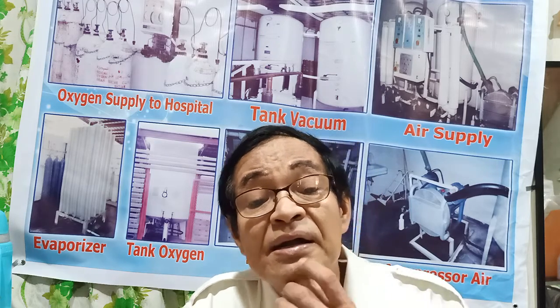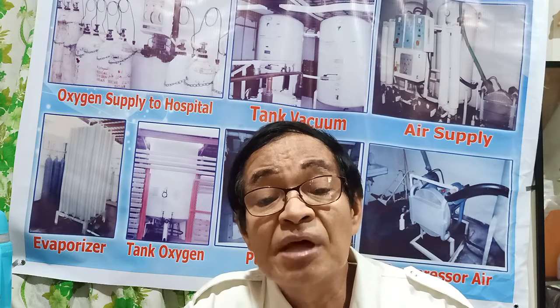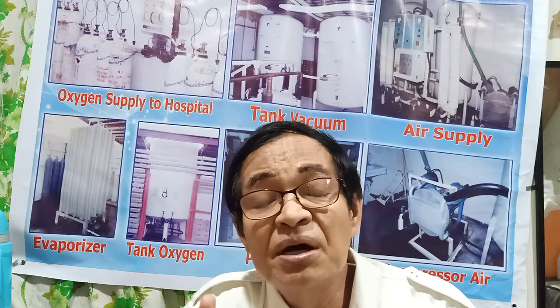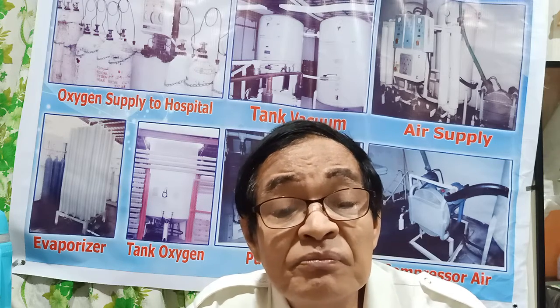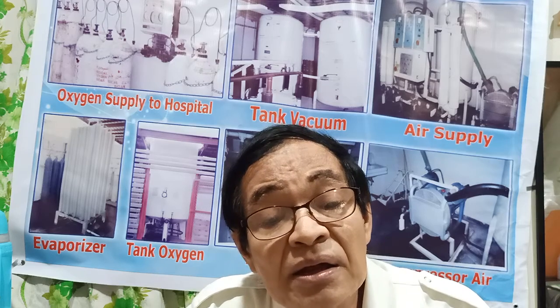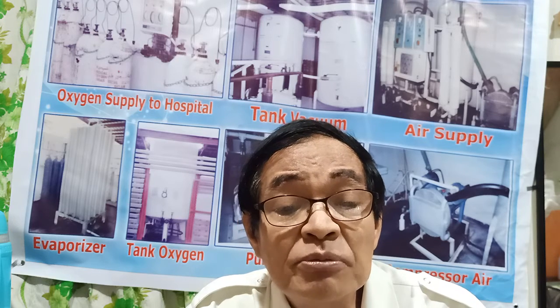Freestanding cylinders are standby. They are connected to the manifold, standby. Sometimes the tank is empty and the standby will alarm. And the reserve mode provides emergency supply of these gases. And then nitrous oxide and nitrogen are supplied from cylinders.